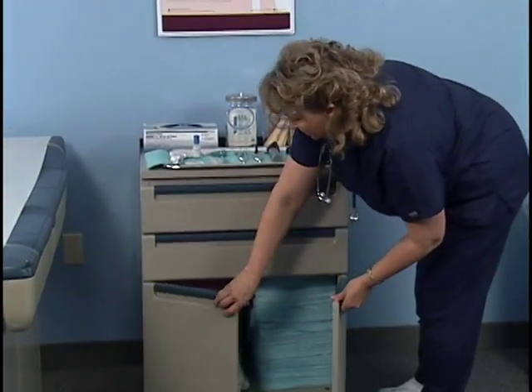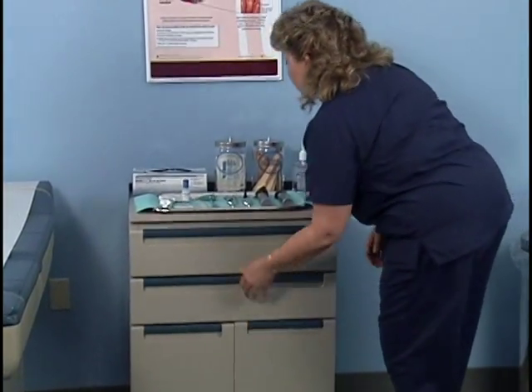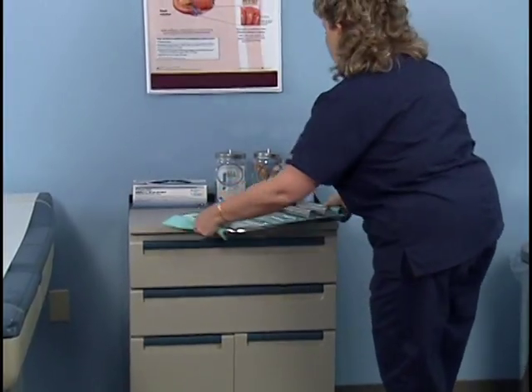Remove reusable equipment to a work area for sanitization, sterilization, or disinfection as required by the medical office policy.